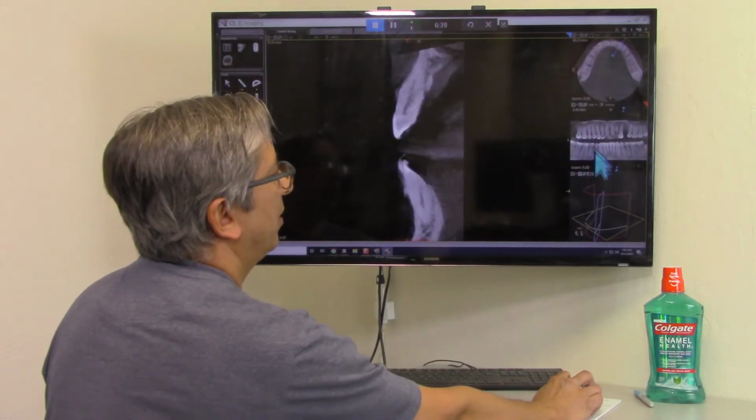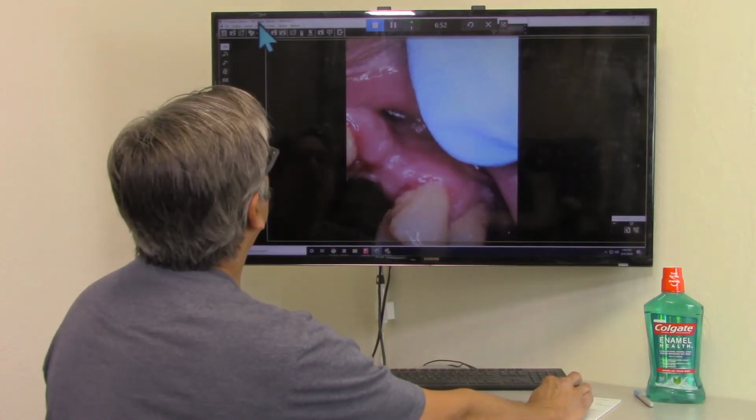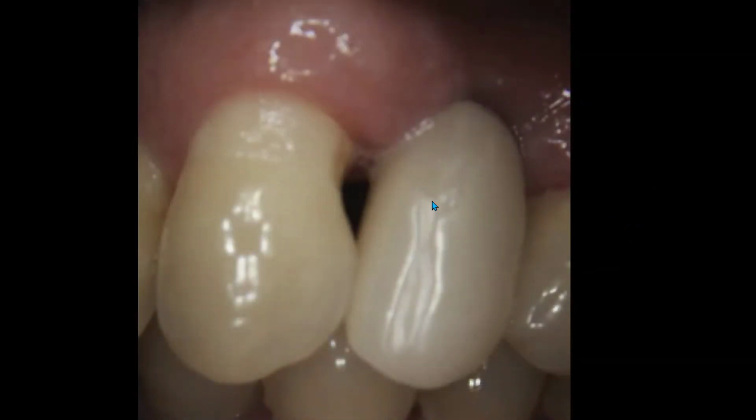And this implant was placed into the site, and it went in pretty well. We don't have a CT or x-ray of that, but we do have a picture of it here. This is with the restoration in place, and you can see here how we have to kind of come out and maintain the contour of the tooth. The result isn't so bad. The tooth matches pretty well. And now you have this situation where you have this contour, and now you have a ditching in here.